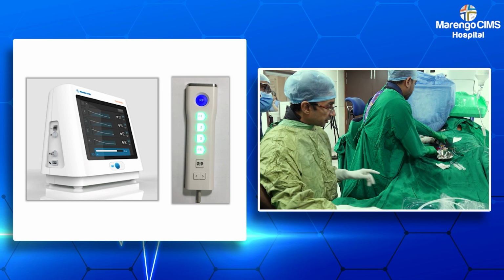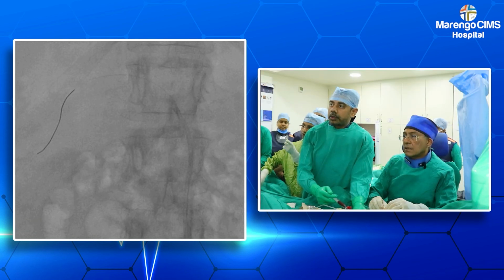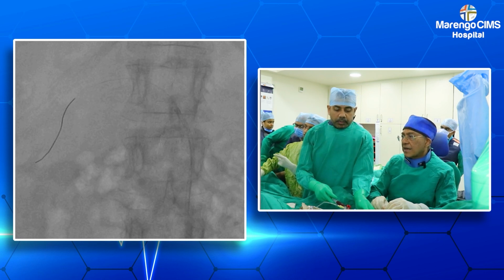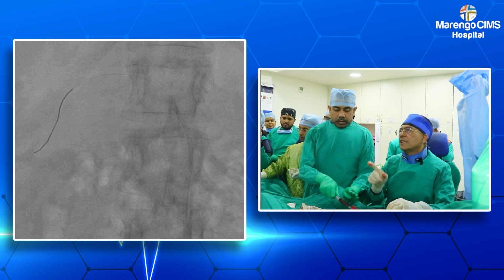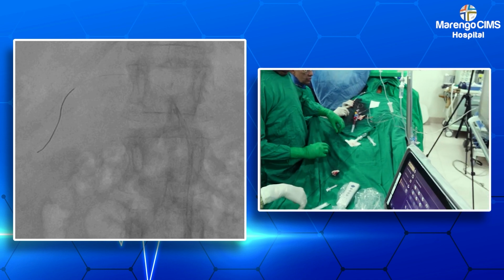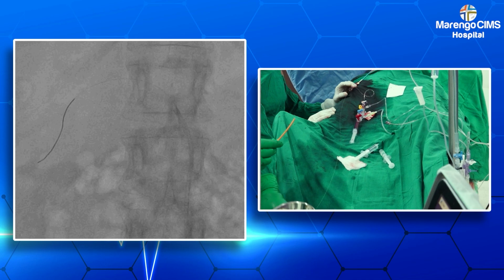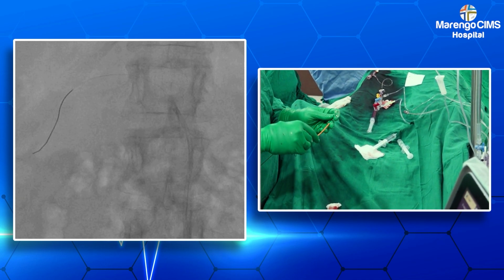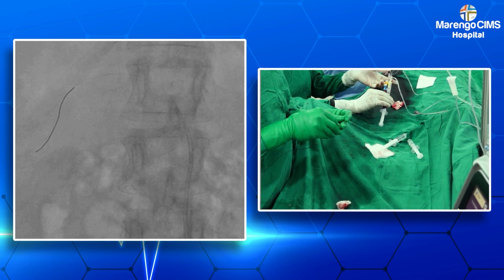So this catheter will be back loaded onto the wire, and with the wire we have already cannulated the renal artery, as you can see, the branches that we want to ablate. So now let's load the catheter. Okay, let's get the ACT. ACT should be more than 250. So we are now loading the catheter onto the wire. Sunil, get the ACT syringe.